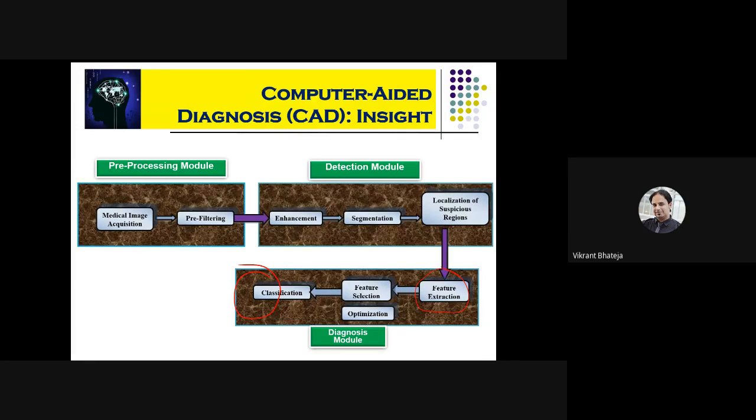Suppose you take an example that we are changing the classifiers, but certainly the accuracy is saturated beyond a certain point. Maybe that is because you are turning around the same sets of images. Just think that this enhancement module may not work properly, or that particular region of interest is not visualized or segmented in a better way.